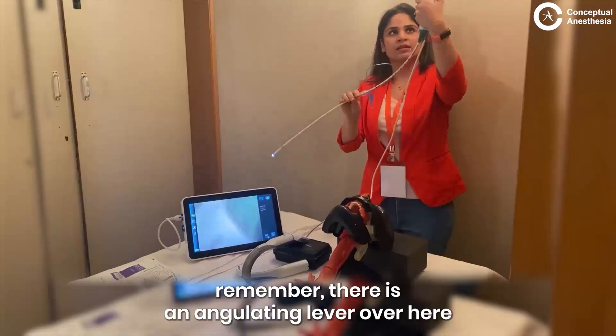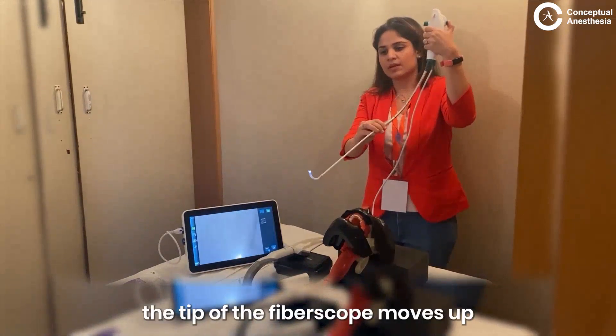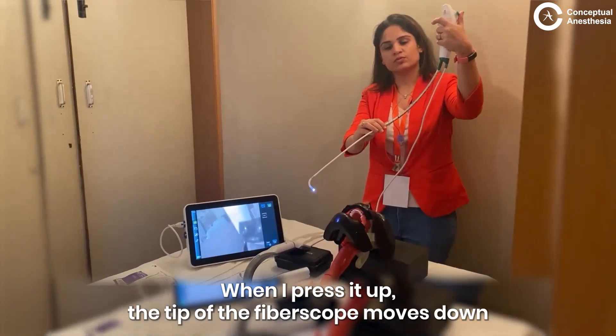Once this is done, remember there is an angulating lever over here. When I press it down, the tip of the fiber scope moves up. When I press it up, the tip of the fiber scope moves down.